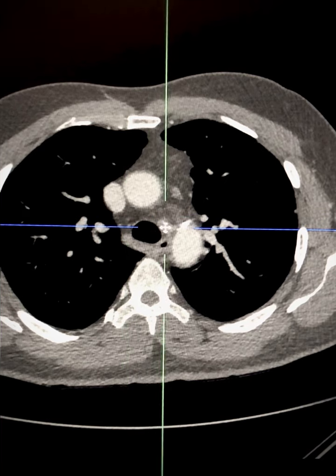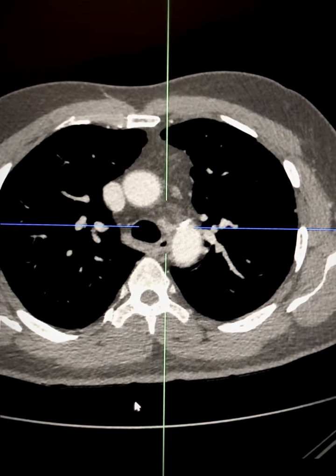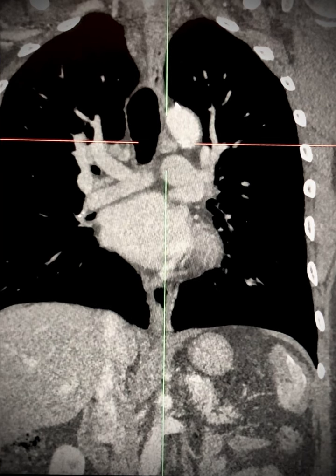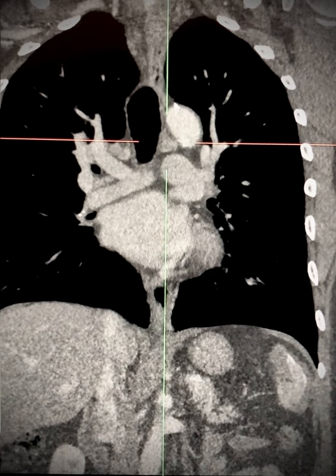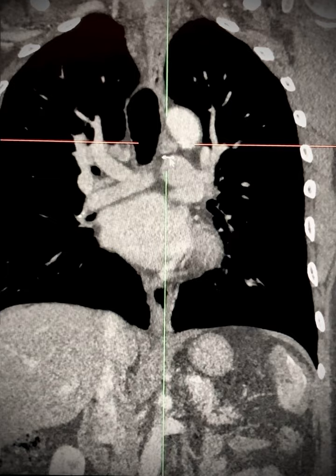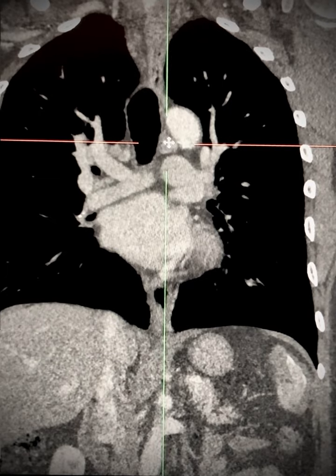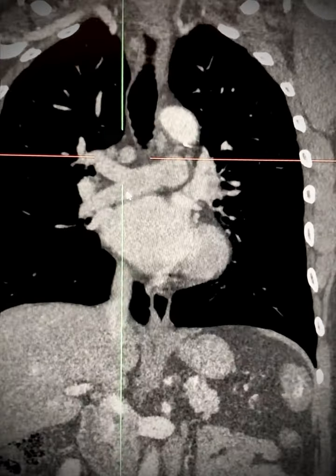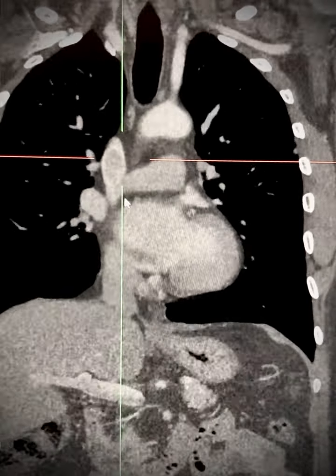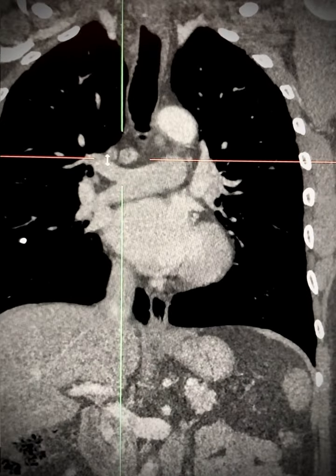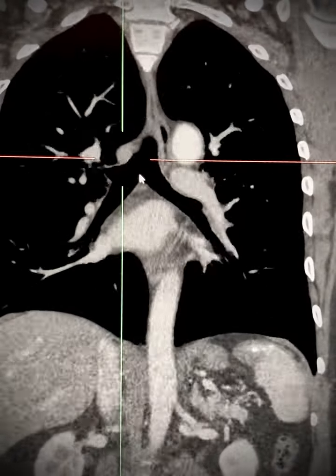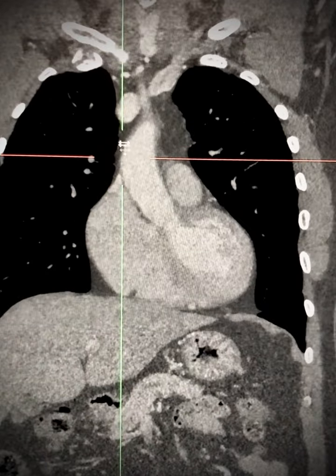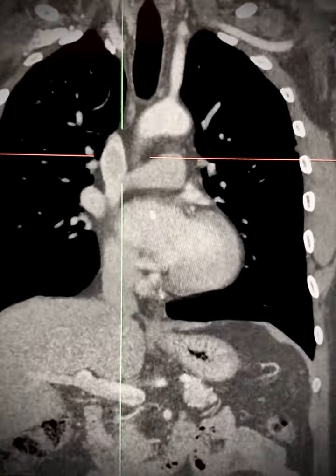We will look at this on a coronal map, and you can see that it is below the superior margin of the arch and above the pulmonary artery, and therefore 4L. And this node here is above the inferior margin of the azygos vein and below the left brachiocephalic vein, and therefore 4R.